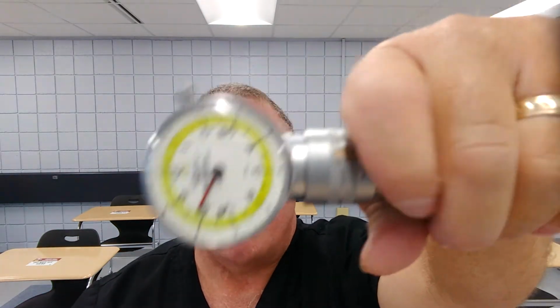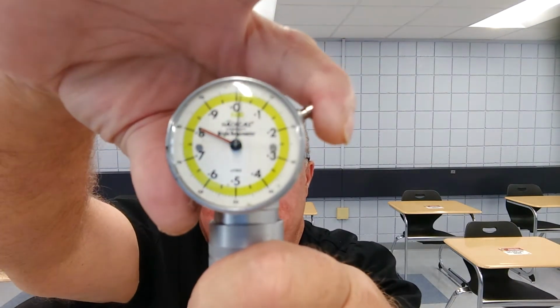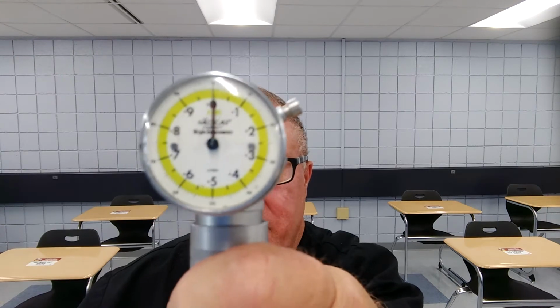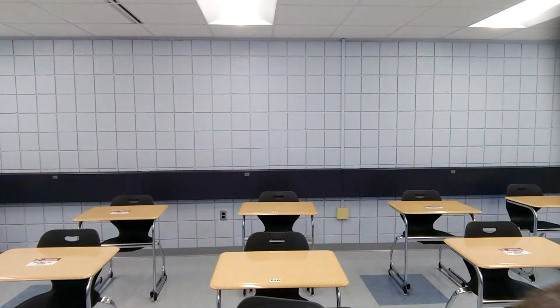Let me show you. Okay, you see the needle's kind of in the middle there. When I press this button here, it takes it back to 0 and resets it. So this resets it, but it also will stop it. So you're going to stop it, look at your number. If you need to do it again, you're going to reset it and do it again. Again, as you can see, there's 4 different ones, and they're all done the exact same way, which I'm going to show you how to do.